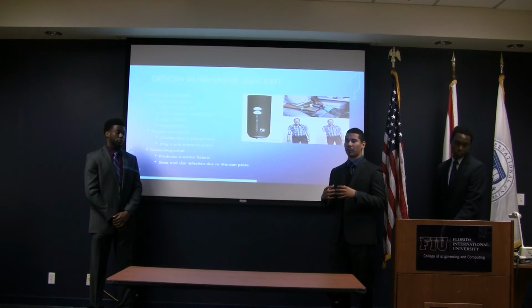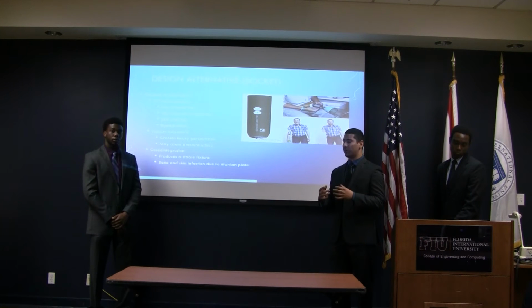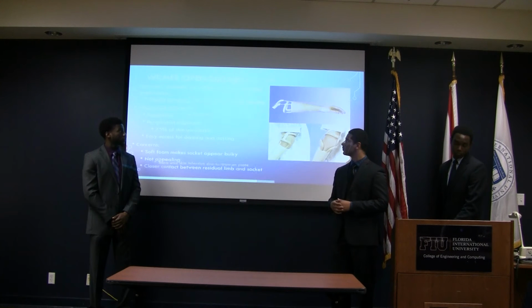Osseointegration deals with implanting a titanium plate directly to the residual limb's bone. From there, a pin will be screwed onto the titanium plate. From there, attachment of the prosthetic to the pin will be available. However, due to this material, bone and skin infection has occurred.